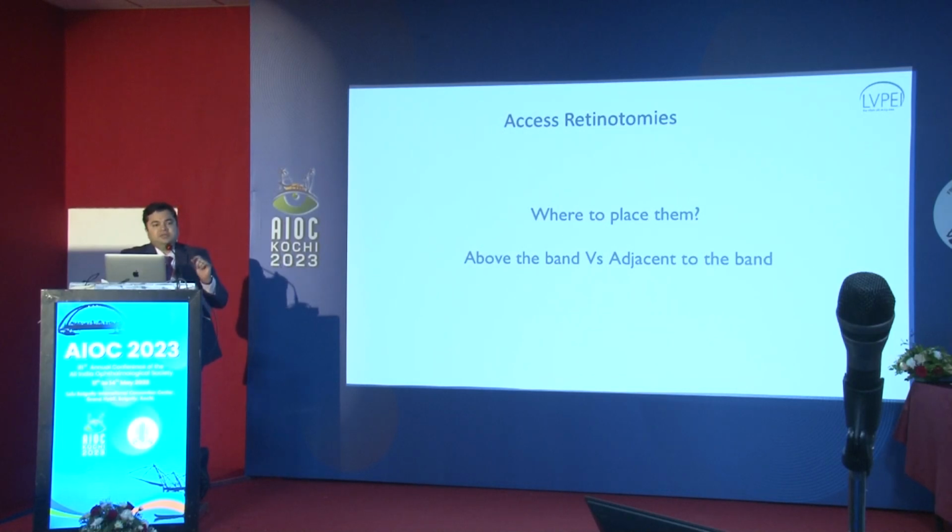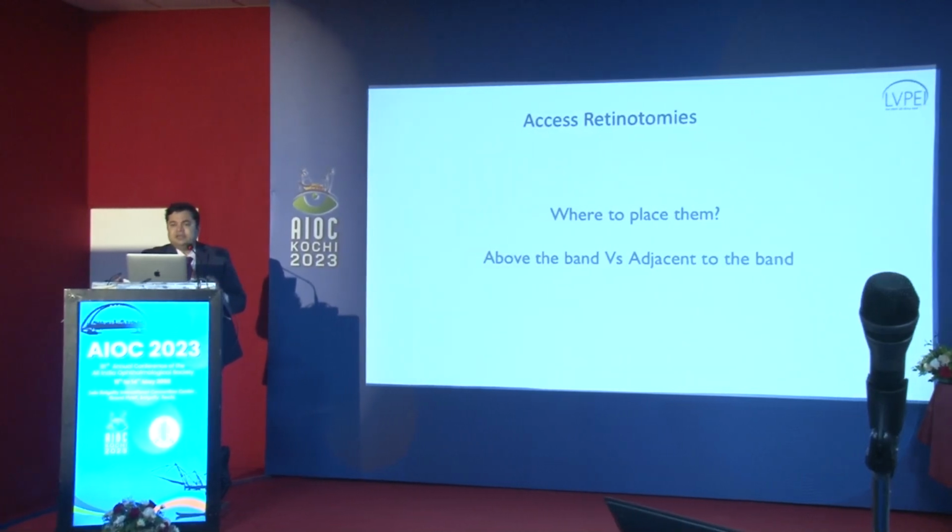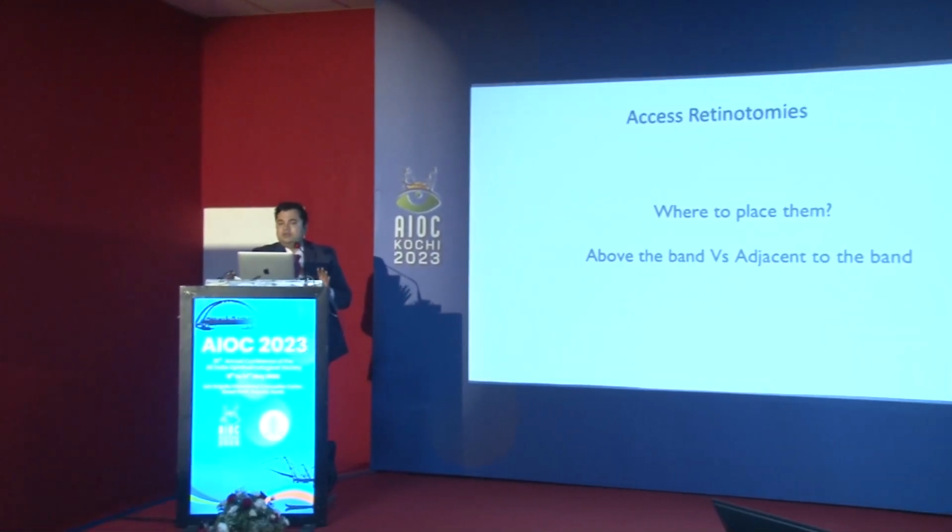Right. So here it's important to understand that if you're placing it over the band, there is a chance that you can damage the band, and the band can itself snip and it may retract. Then it's difficult to go and retrieve. If it retracts and still there is no traction, then your job is almost done.